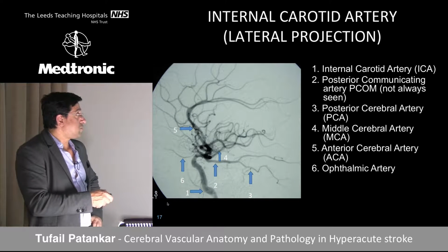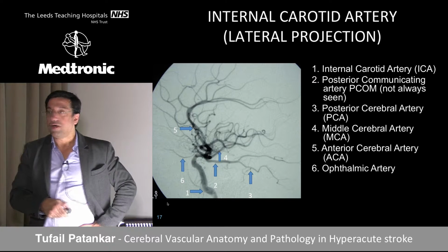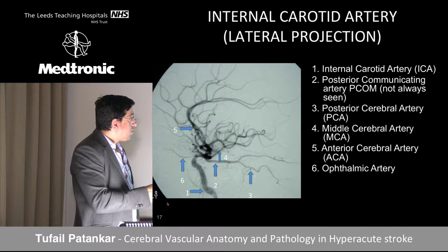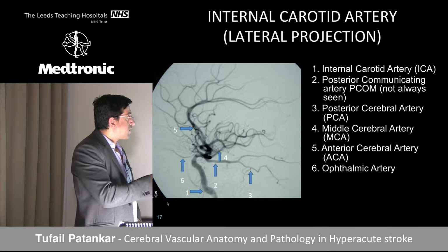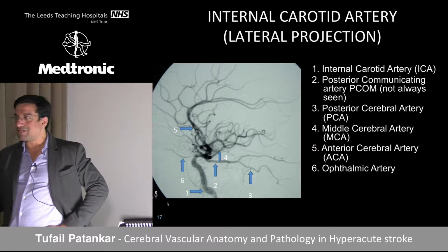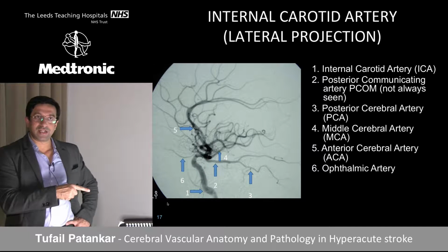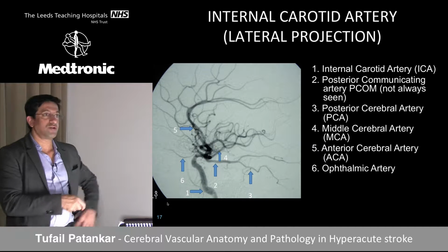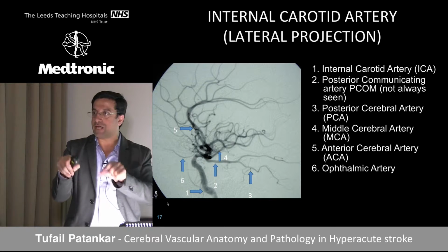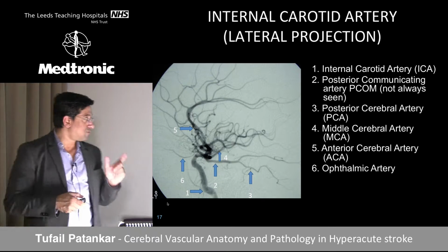The best way to know is this triangle. Always remember on a lateral view or on a CT scan, you have the anterior cerebral artery and all the MCA branches filling into this triangle. When this triangle is empty, you know there is a branch missing. So when you don't see it on the lateral, and you don't see much flow there, you know that you have to turn your CTA to find that branch. MCA can be tricky. M1 is okay. Once you go to M2, you have to look for it.